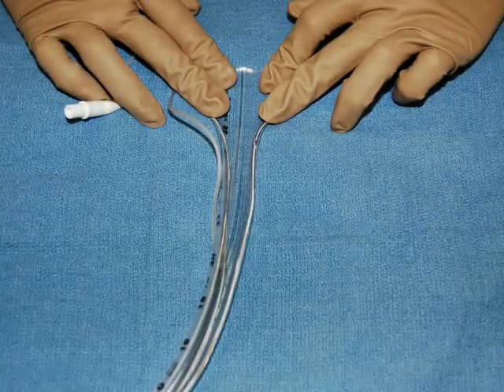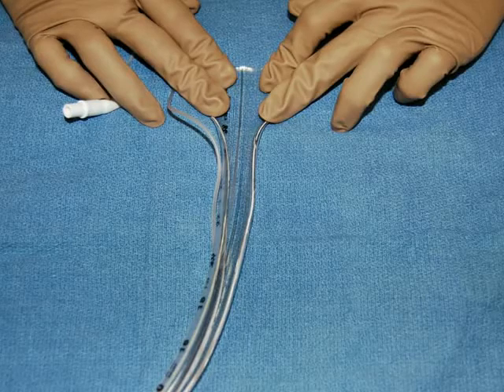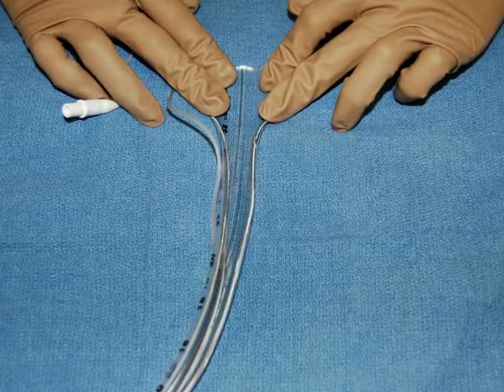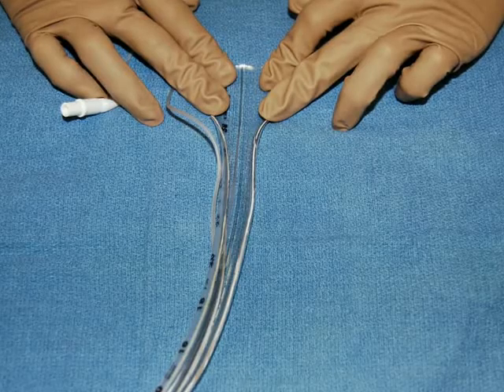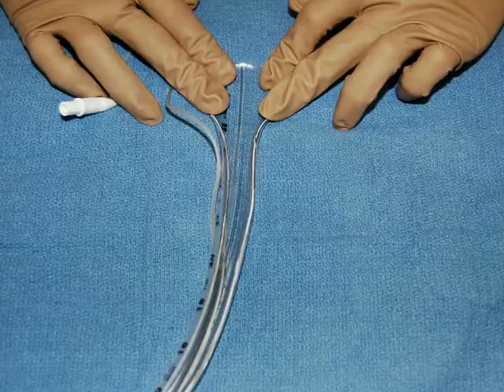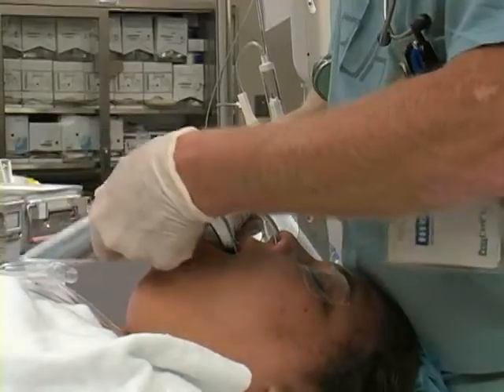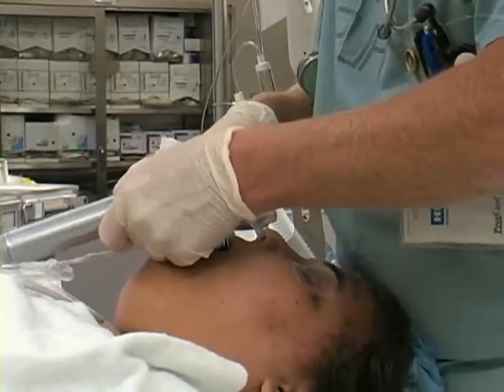If you cannot advance the nasogastric tube into the esophagus with the previously mentioned maneuvers, an alternative method is to obtain an 8-0 standard endotracheal tube. Using stout scissors, cut down the length of the endotracheal tube. Using a laryngoscope blade, perform laryngoscopy as needed for intubation.